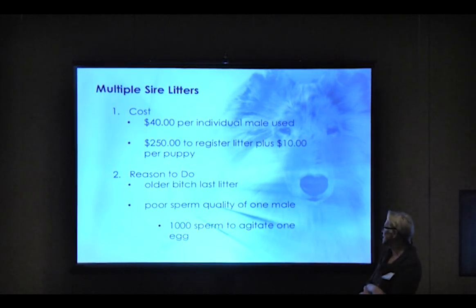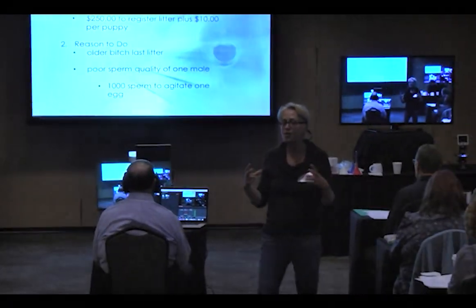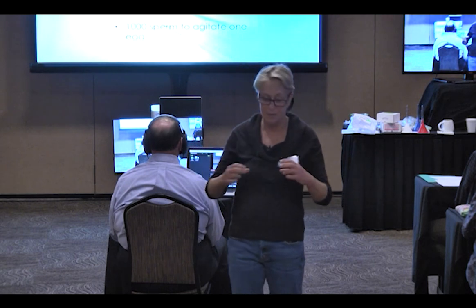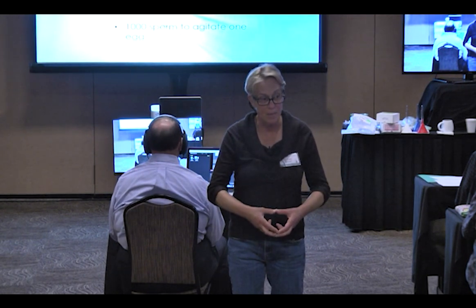And the other thing is poor sperm quality of one male. Remember, I told you it takes 1,000 sperm to agitate an egg before that one lucky guy gets in. So if you have a dog that has poor sperm quality and a dog with good sperm quality, I would mix the two together, and then look at it to make sure they're not killing each other, because that could happen. Sometimes you have tough sperm. If they look fine together, then I would inseminate them together at the same time, and then hope that the right ones get in.